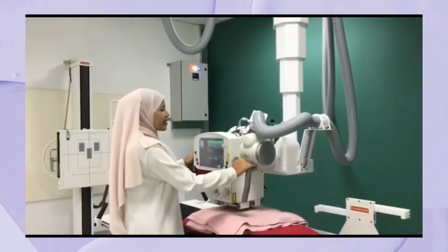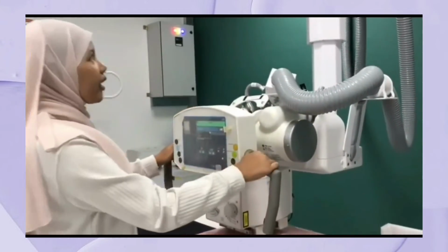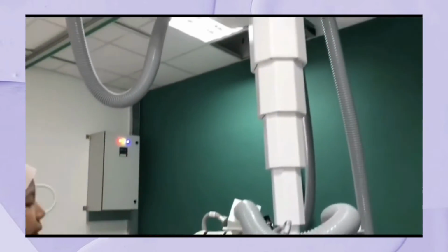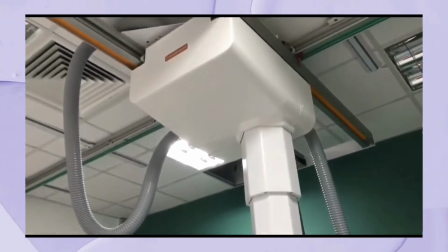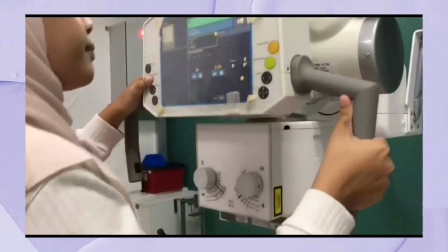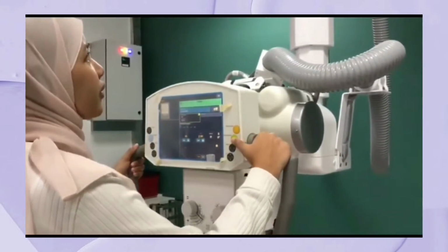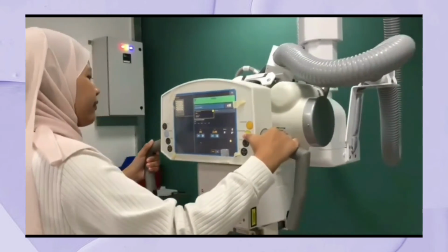Okay. So this is the tube, the X-ray tube. This is the X-ray housing. Okay, this is the tube support. We'll be able to control the tube support by pushing these buttons. Okay, we can go up and down. Also, we can go to the right and to the left.